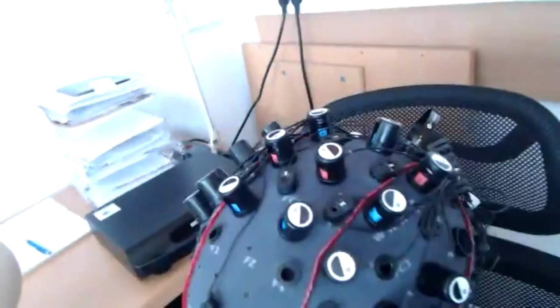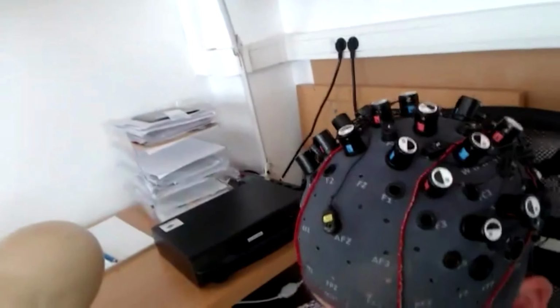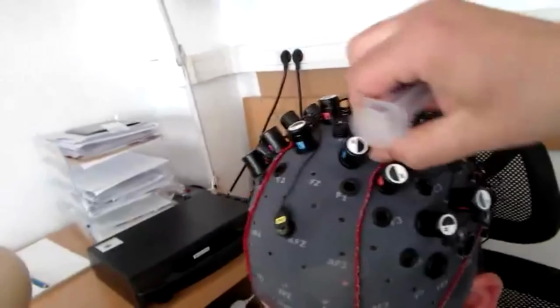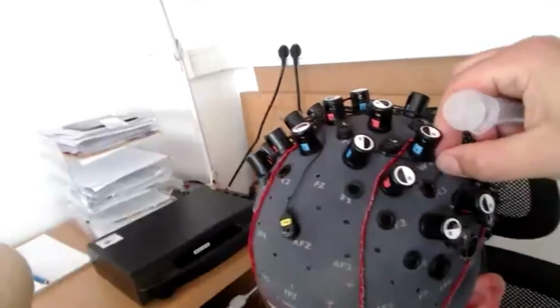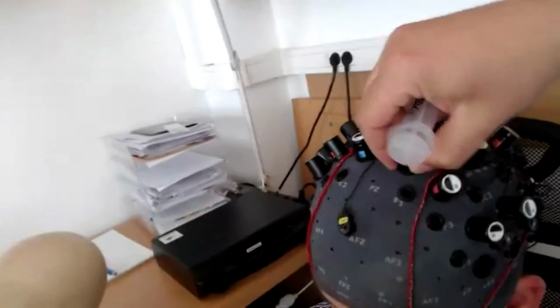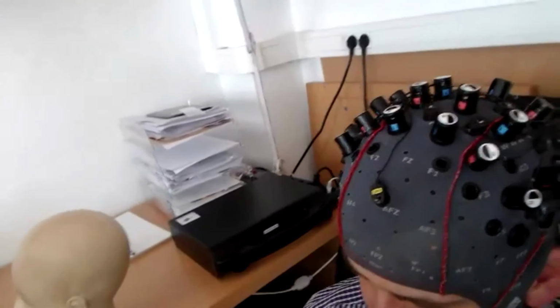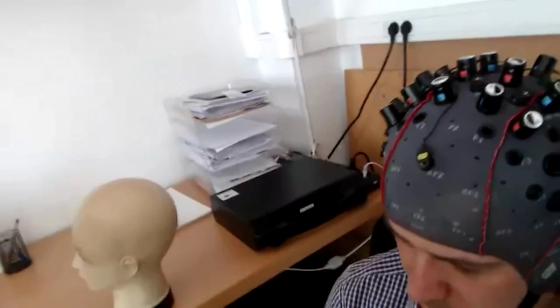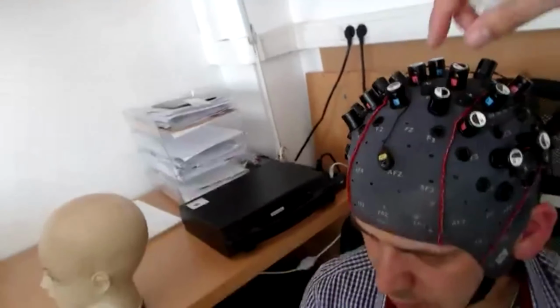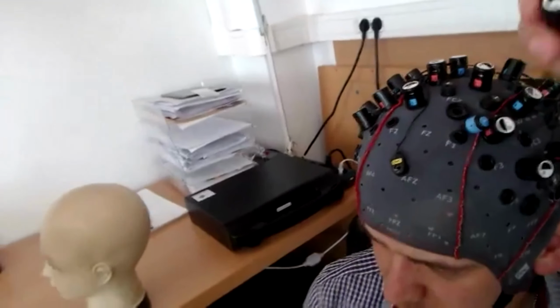And I will show you in a bit how to optimize all the signals. There are different holders, because if the signal is pretty bad, you can first of all make something like this with the electrode, with the holder, so the tip of the optode gets to the skin. If it's not working like this, you can switch this holder with another one.